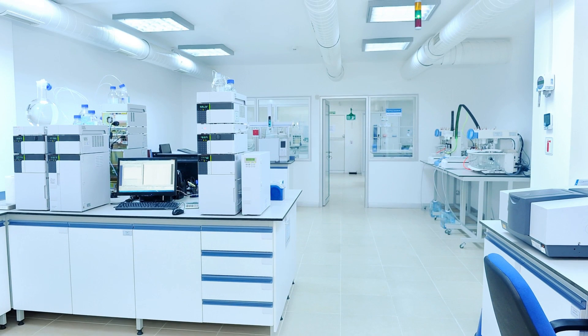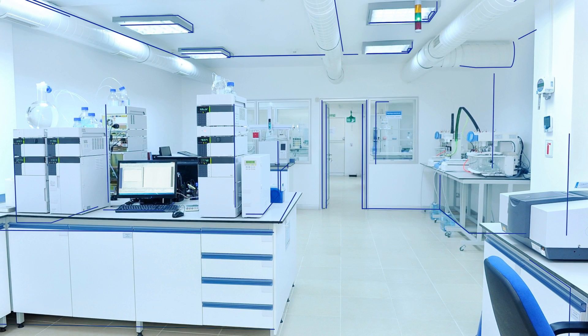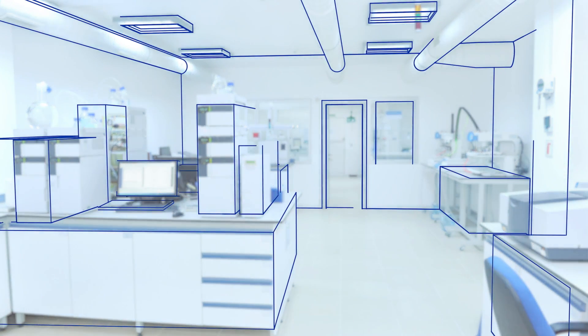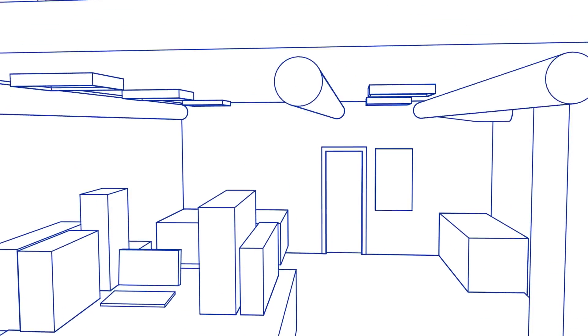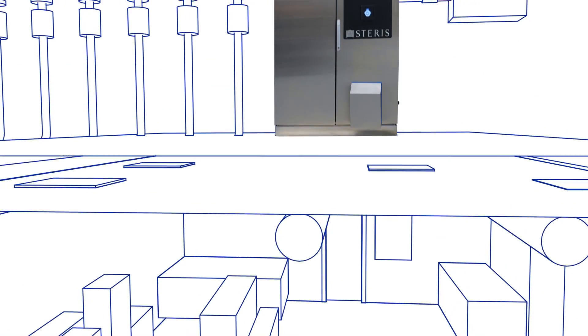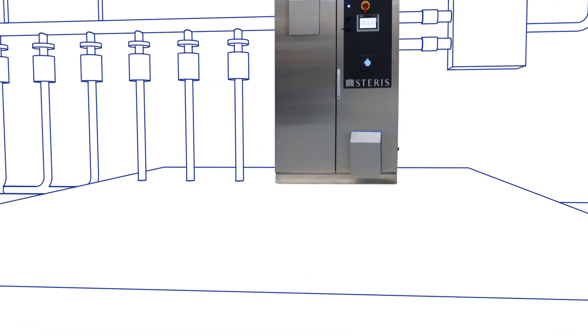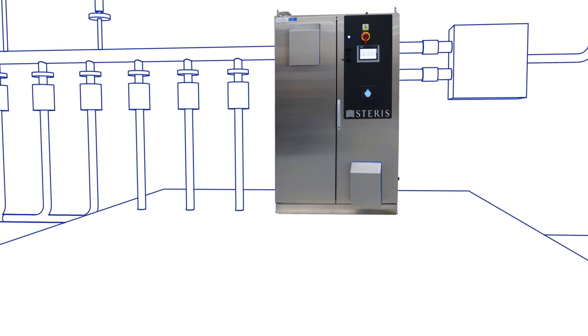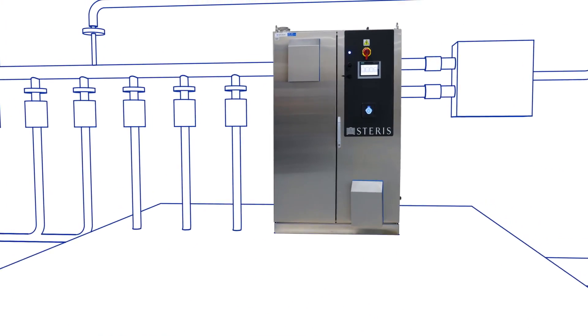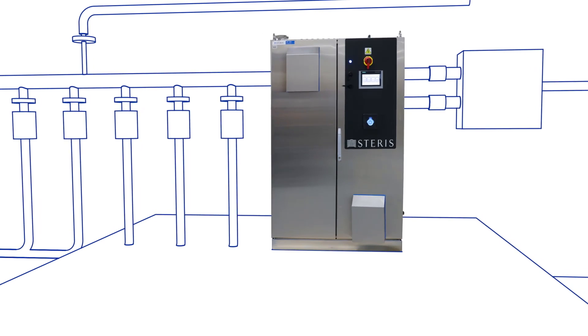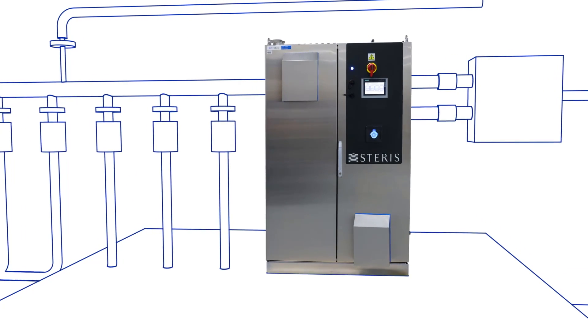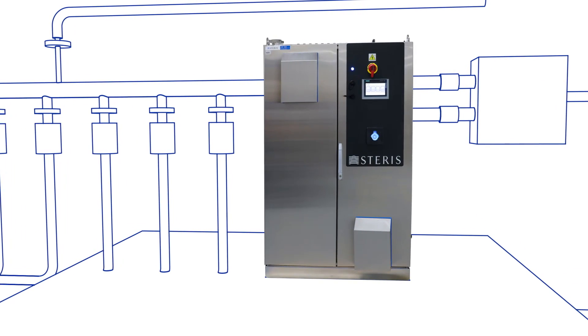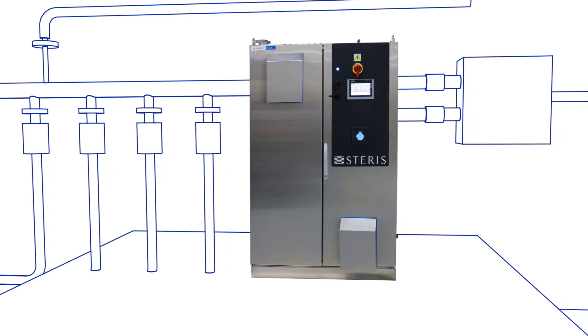Steris integrated VHP systems meet these challenges, giving life science professionals a powerful tool to effectively and economically decontaminate large areas, achieving a repeatable six-log bio-burden reduction.